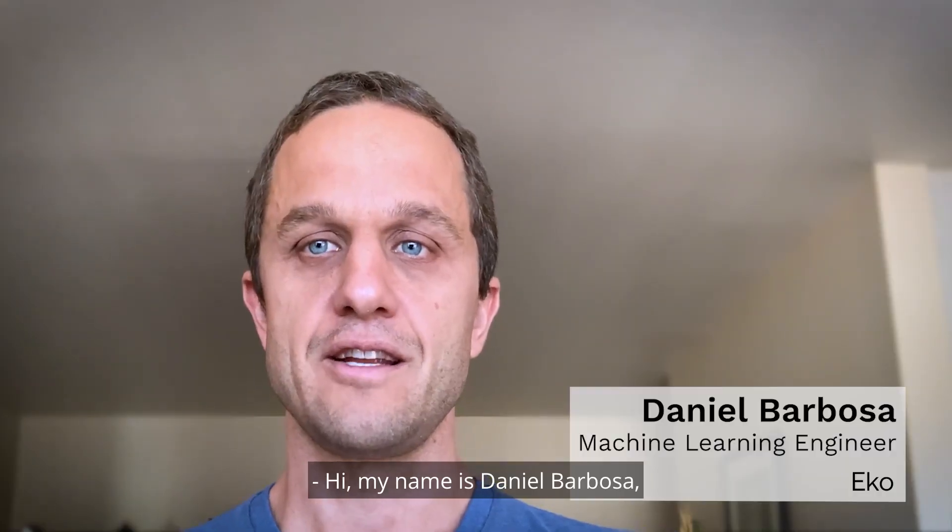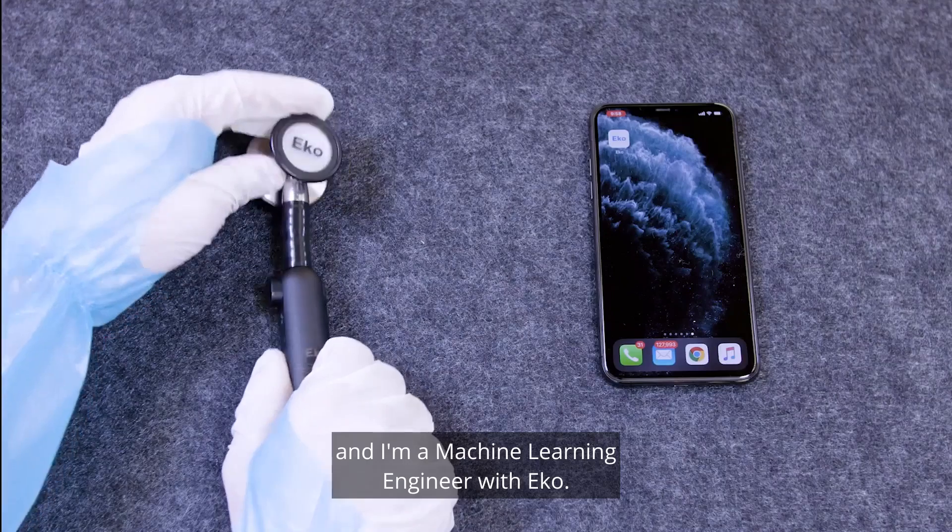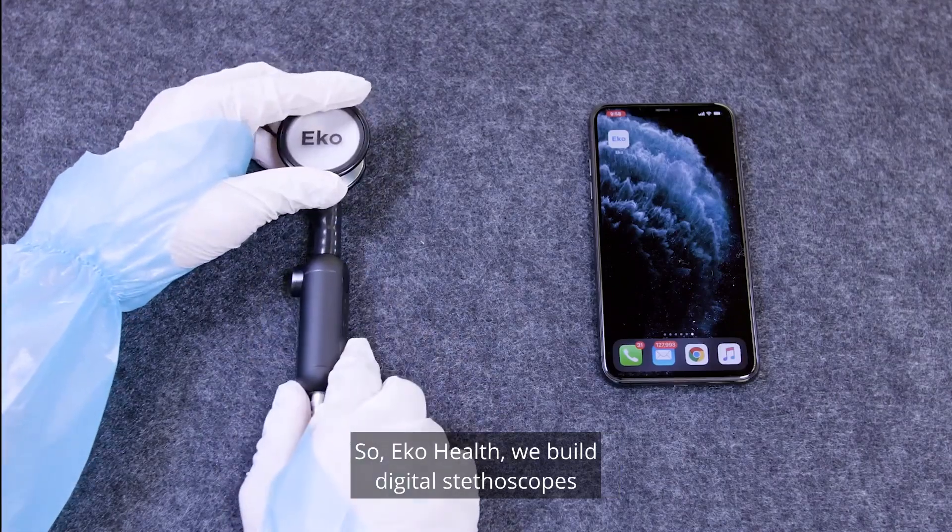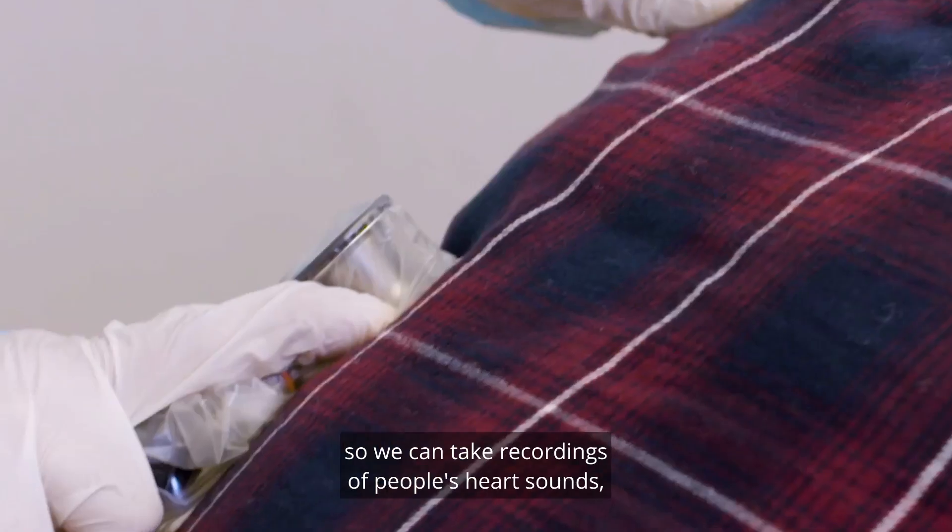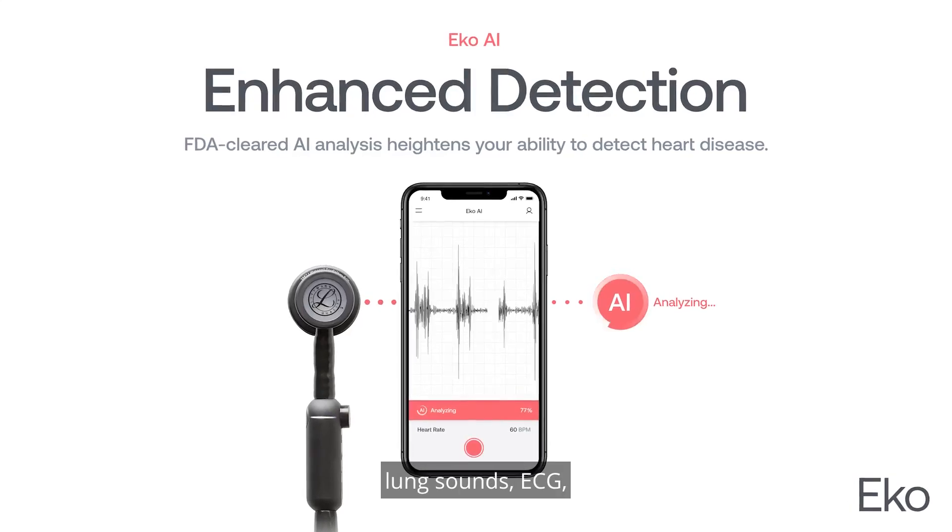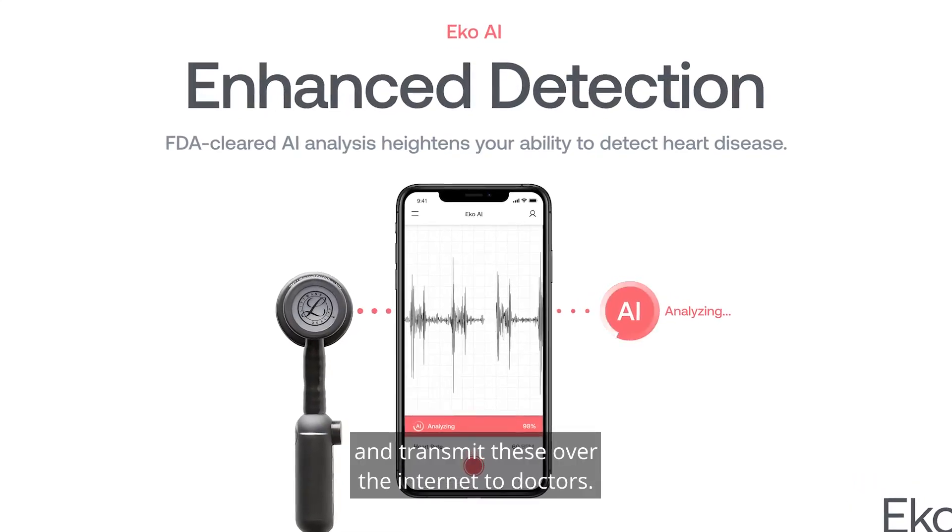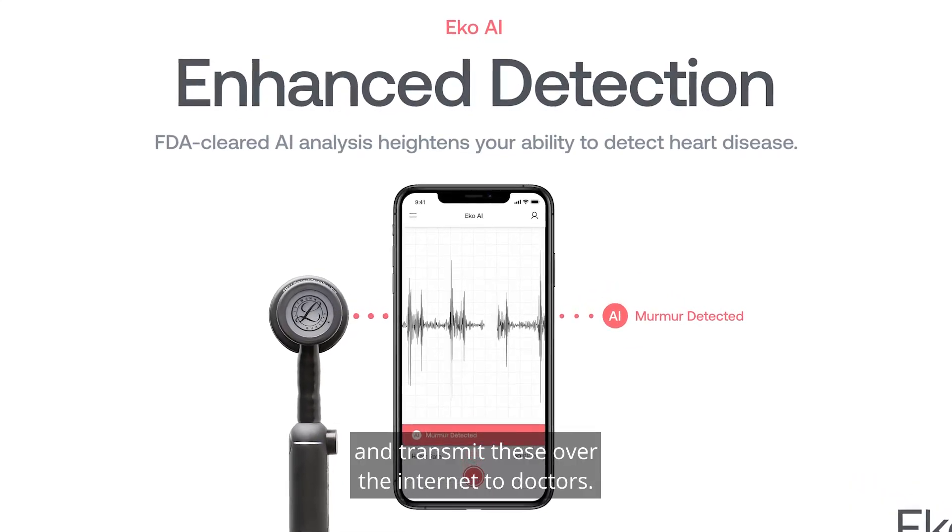Hi, my name is Daniel Barbosa and I'm a machine learning engineer with Eko. So Eko Health, we build digital stethoscopes so we can take recordings of people's heart sounds, lung sounds, ECG, and transmit these over the internet to doctors.